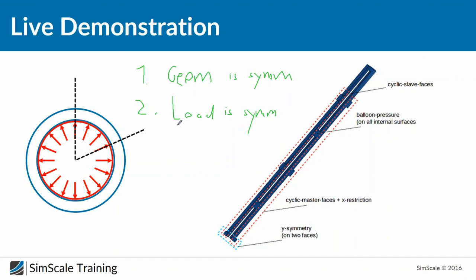Here you can see the stent geometry — the symmetrical part. What we will do is apply symmetry on the outer and inner surfaces, and also symmetry on the lower surfaces. We will fix one side and apply the force on the inner surfaces. That gives us our simulation model. Our workflow today will be: import the geometry, create a mesh, set up the simulation describing how the stent interacts with the balloon and vessel, and finally analyze the results and do post-processing.